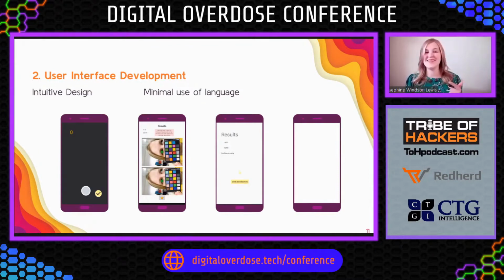Once you've done that, and you've done it a few times because this is science and we love to average things, you move on to the results screen. That's going to pop out a result for an SCB, which is just a bilirubinometer reading and a diagnosis, because we want to make this simple for the end users. So it's going to say, does this baby need further investigation for jaundice? Yes or no, and a confidence reading, so that people can feel confident in the output of this app.